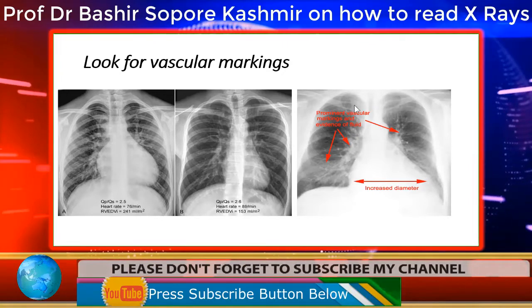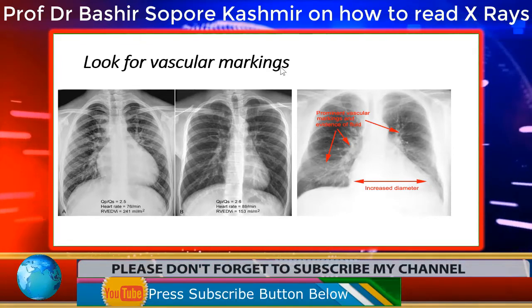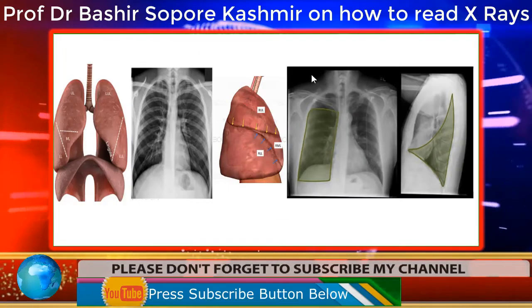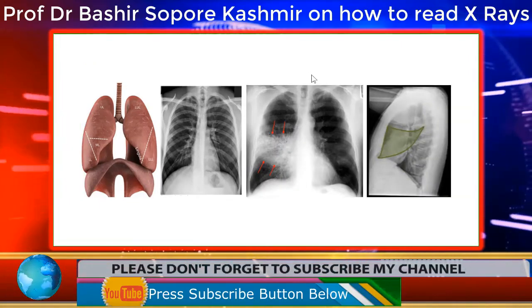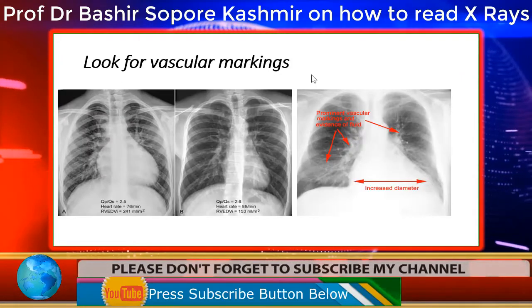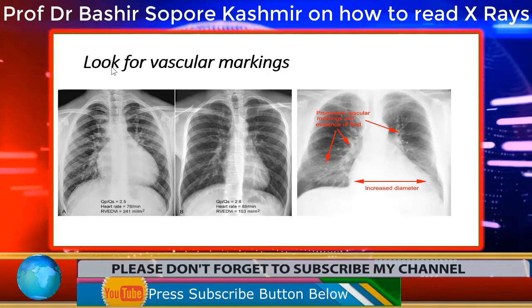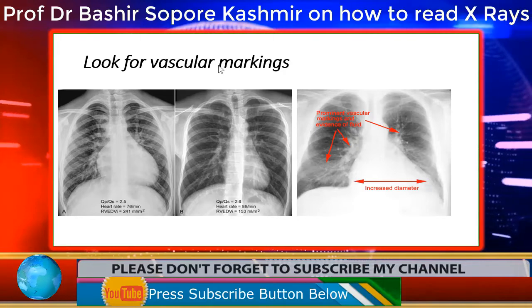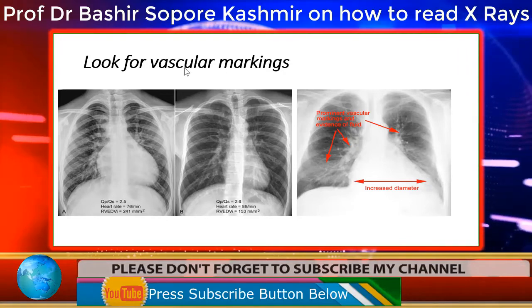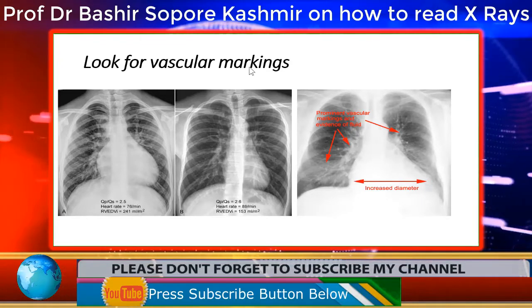So after this, let us talk about the vascular markings. Now, after noting the different lobes of the lungs, we talk about the vasculature, or pulmonary vasculature, or vascular markings.